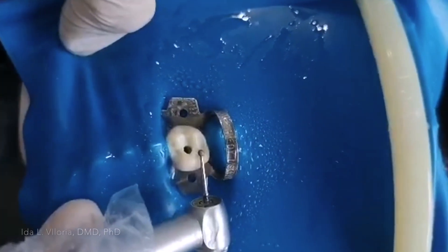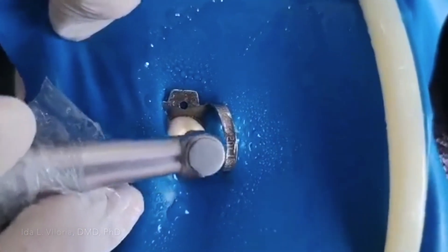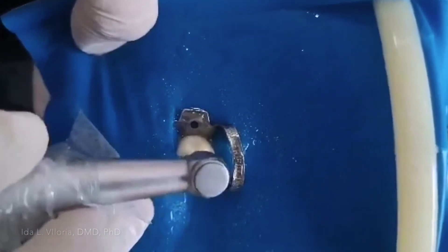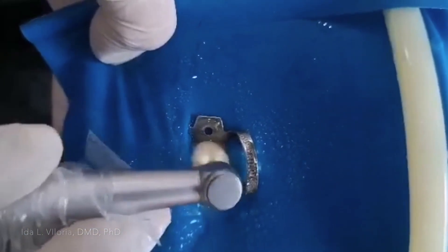I'm still using the long shank round burr, but I have changed it to a little bigger one since it can now get inside. Then I'll go towards the buccal. Make sure it is aligned with the long axis of the tooth to avoid gouging. Continue this until you don't feel any touch anymore.